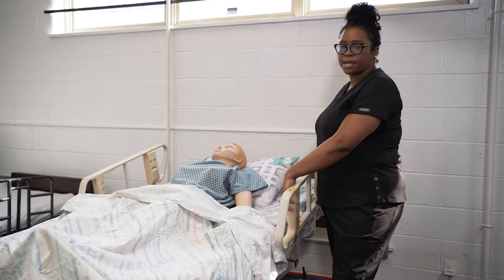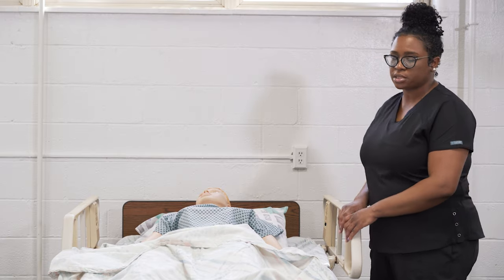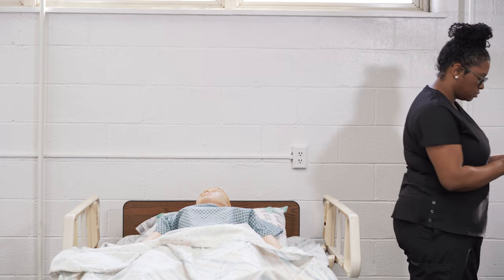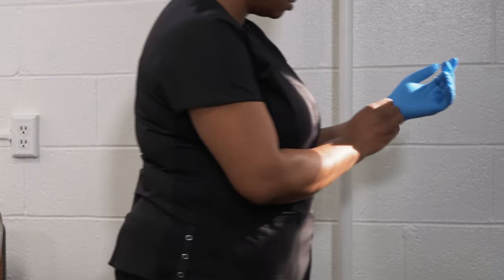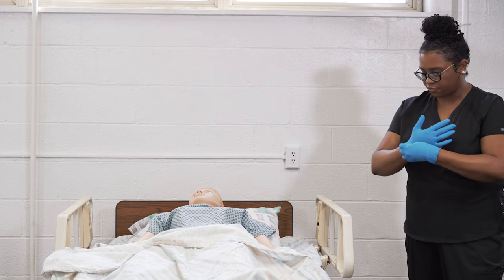Because we need to grab the bed pan or fracture pan, it is considered a dirty piece of equipment. So you always want to get your bed and your resident ready first. Then you're going to put on your clean gloves and grab your bed pan or fracture pan. Following the gloving procedure, you're going to don your clean gloves. Keep your side rails up while the bed is in high position or at working height to prevent the resident from falling.